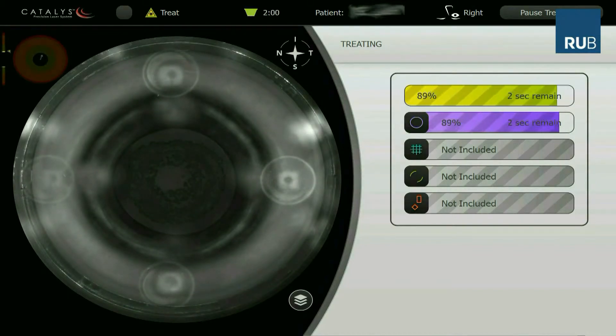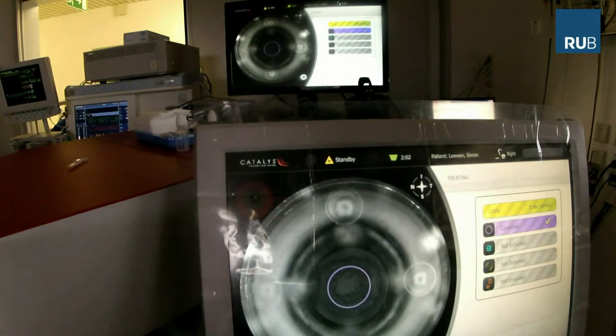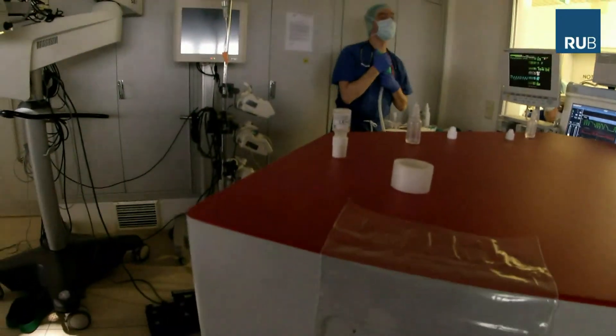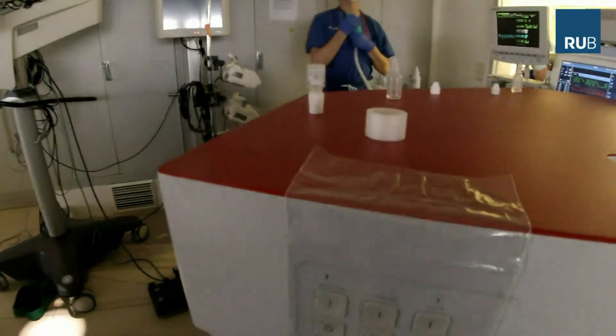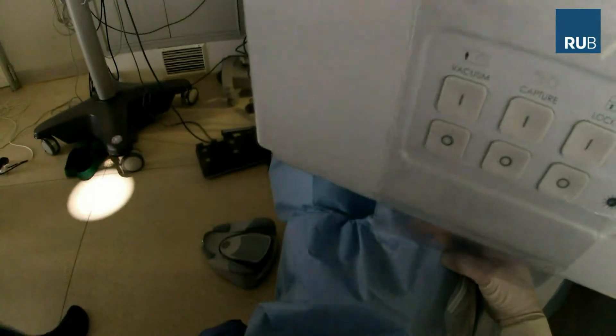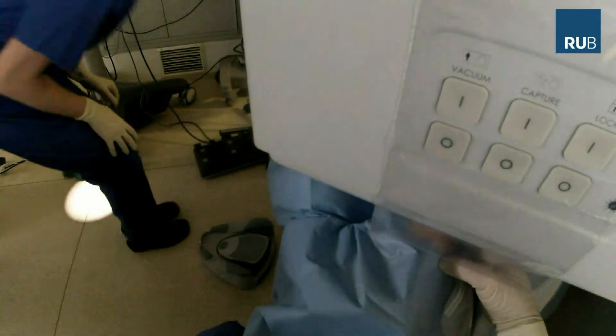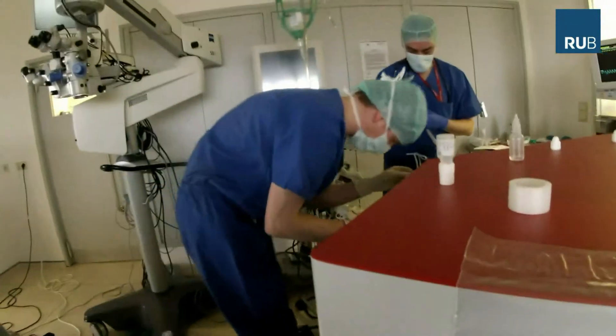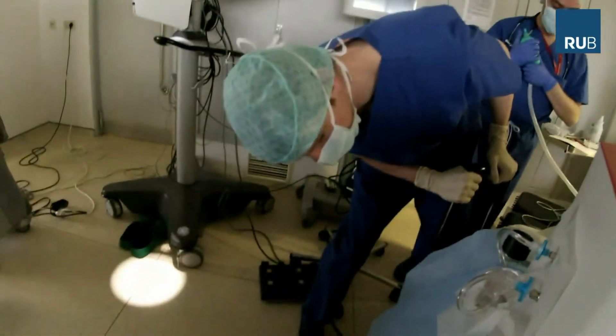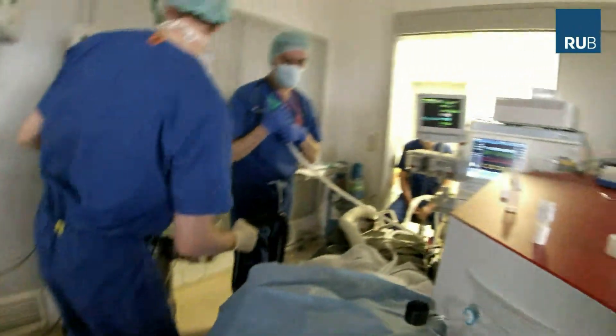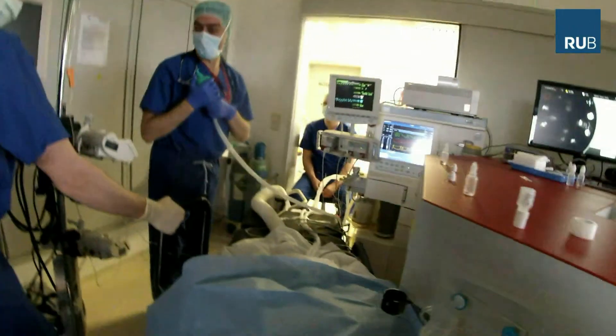After undocking, the patient bed is swiveled to the side to continue the surgery under the microscope. In this case, the laser-treated posterior capsule was already curled and moved to the lateral side.